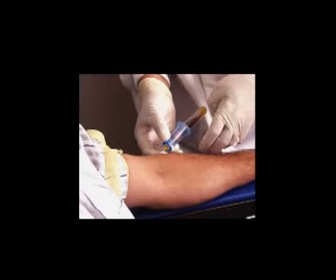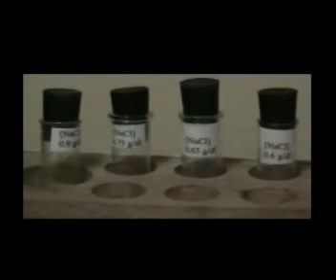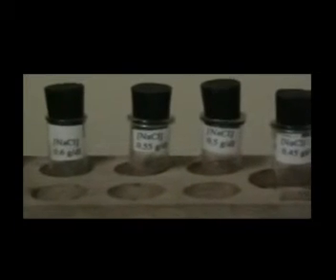For this practical, we need to collect some blood. So we need 2.5 milliliters of anticoagulated blood, 12 test tubes, sodium chloride preparation, and a centrifuge. Those are the main things we need. Here you can see 12 test tubes, starting with 0.9 gram per deciliter sodium chloride. Each tube contains 10 milliliters of sodium chloride solution in different concentrations down to 0.1 gram per deciliter.